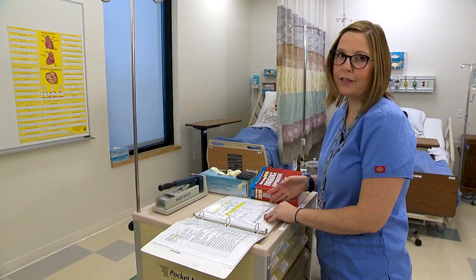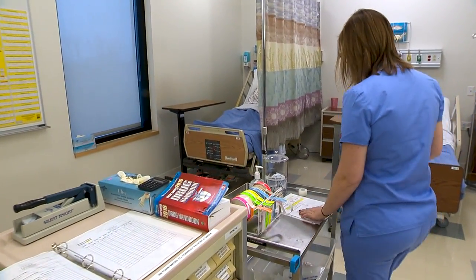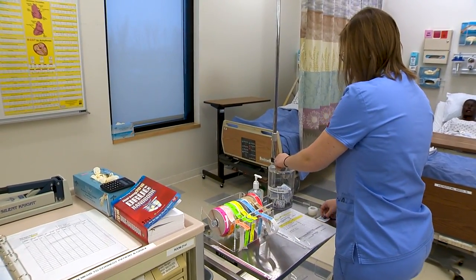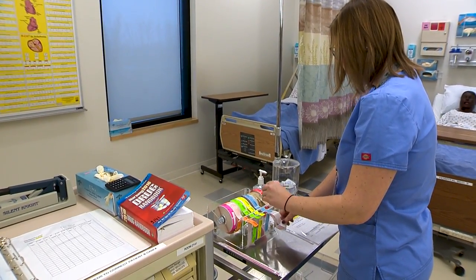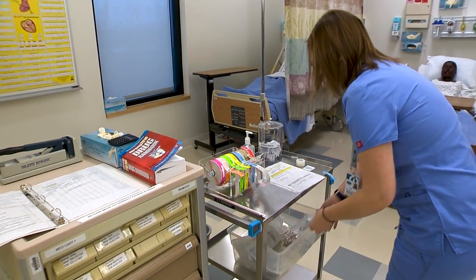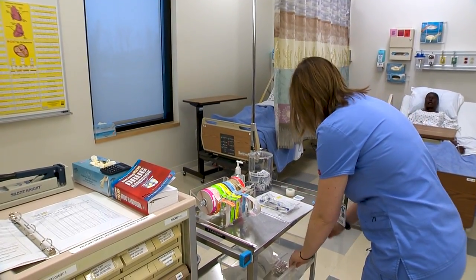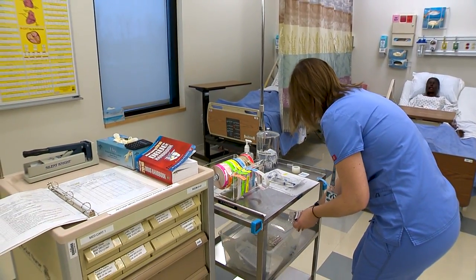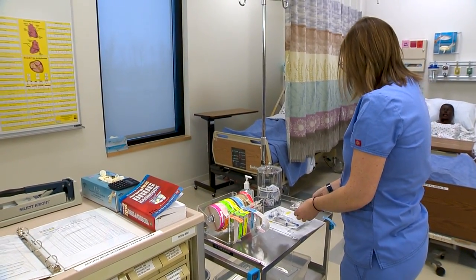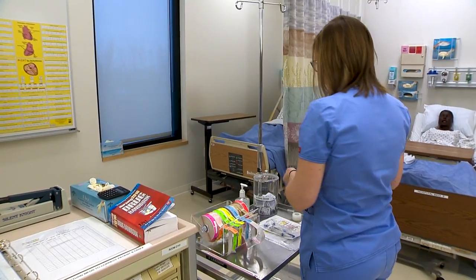So now I'm going to gather my equipment. I need an alcohol swab, a date sticker, secondary tubing or piggyback tubing, my medication, which is the ciprofloxacin, and now I'm going to calculate my rate.